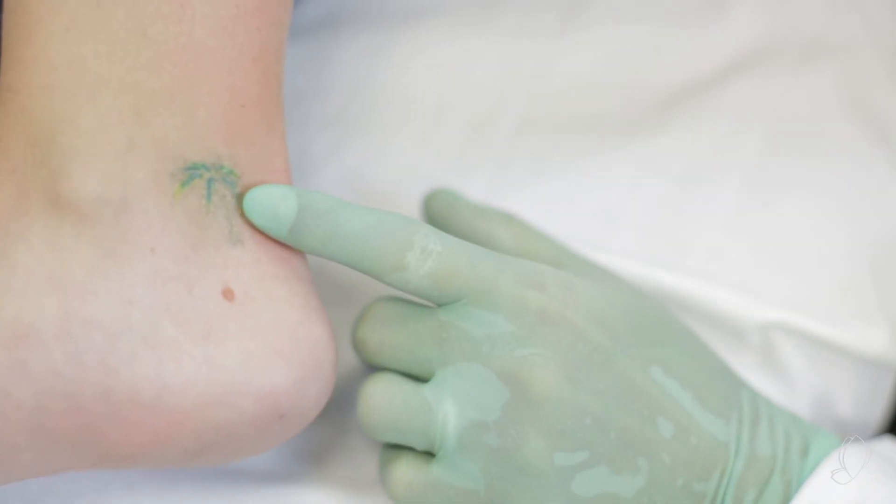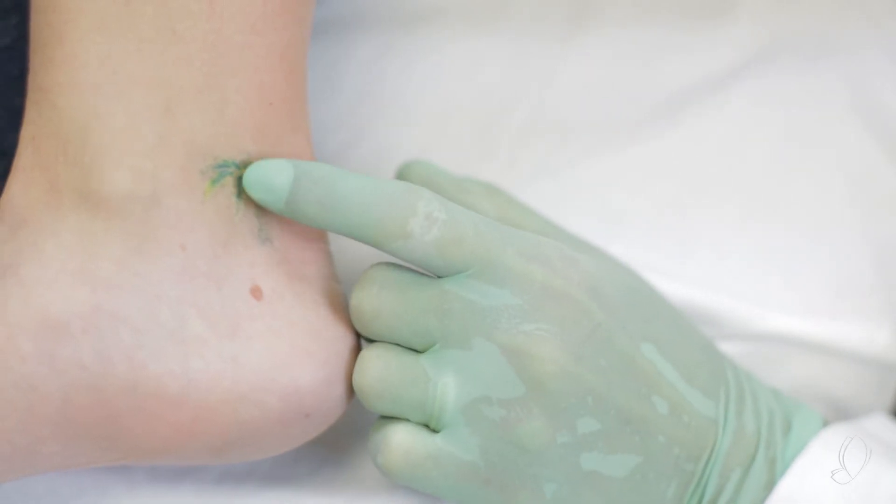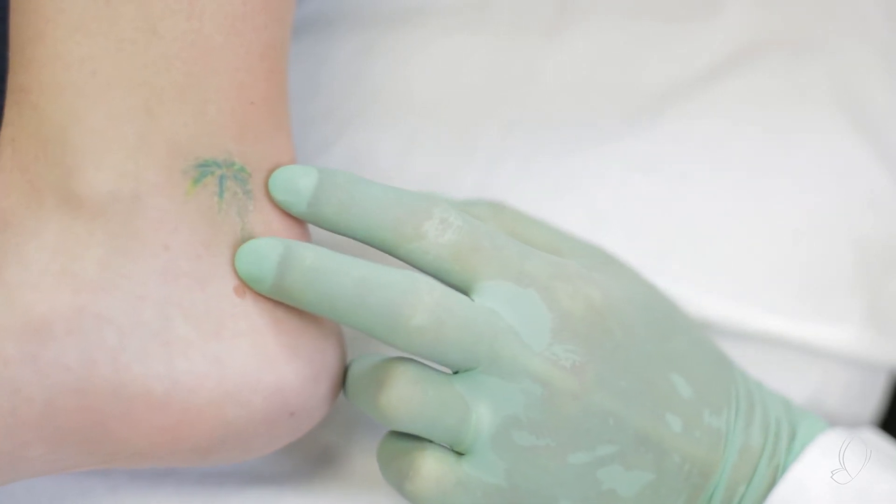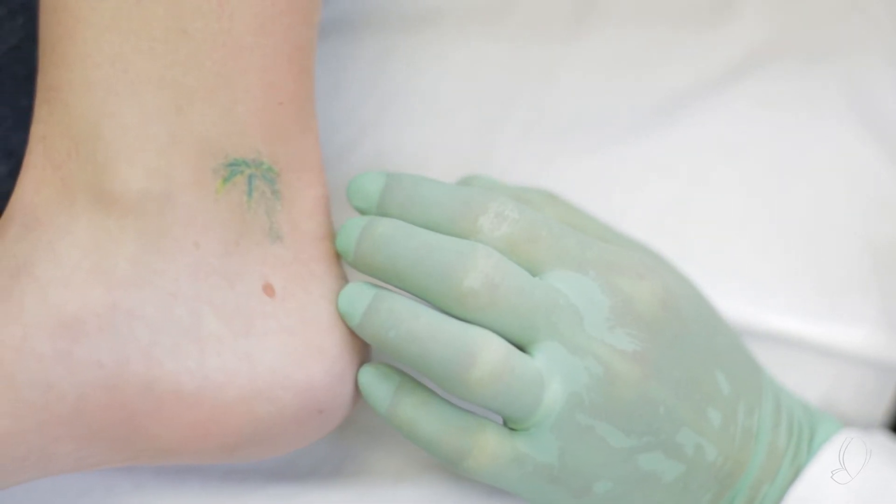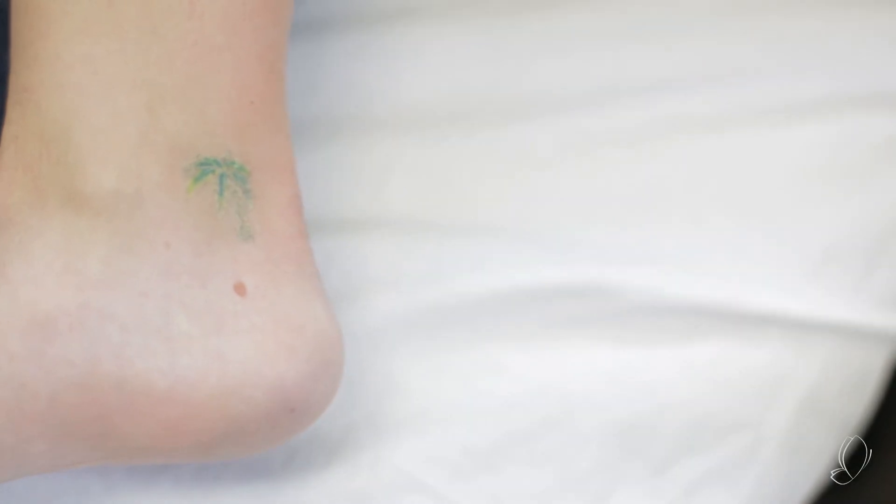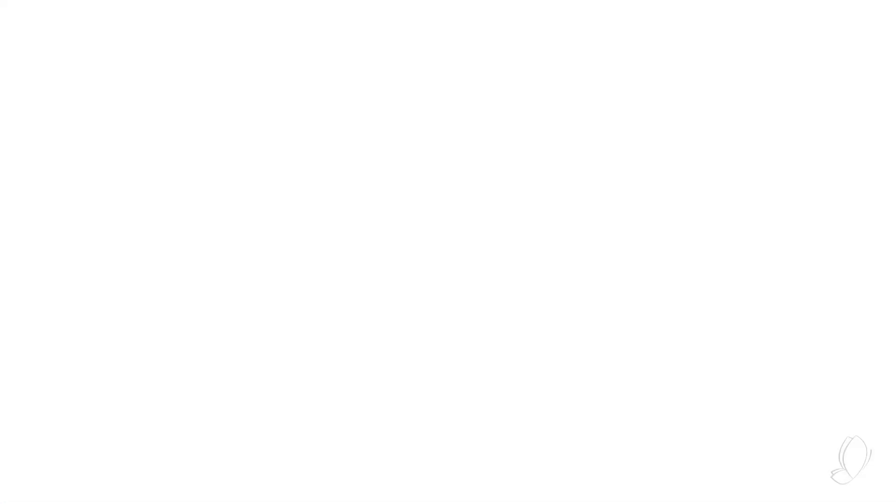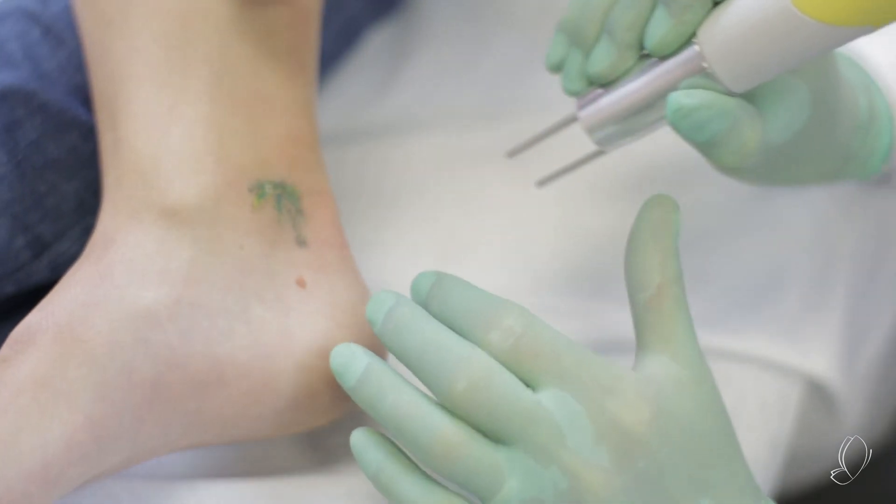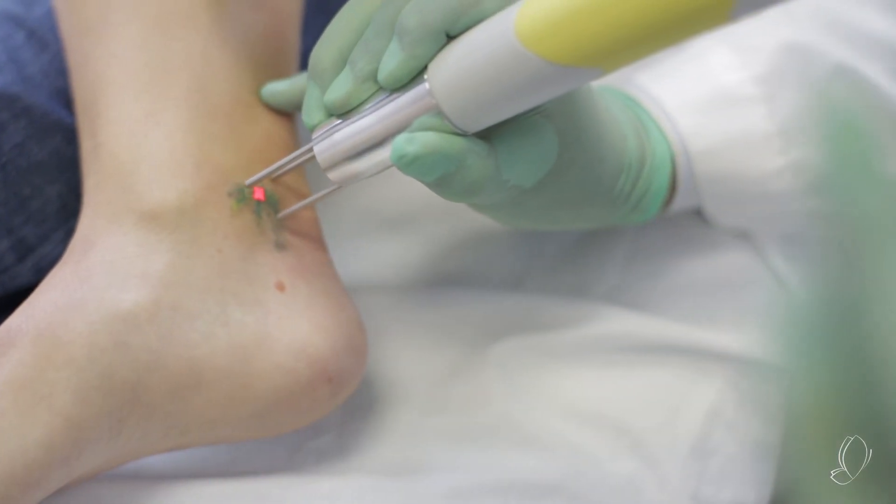Now what I could do is I could go back to our 694 wavelength, the Ruby wavelength, and specifically get some of those green spots. Again, because we didn't over-treat at this point in time, I'm probably comfortable doing that. Are you all right to take a few more spots? Okay. We're going to go back and just hit some of these green areas here with the 694. Three, two, one.